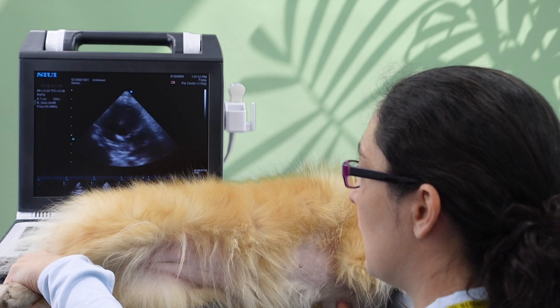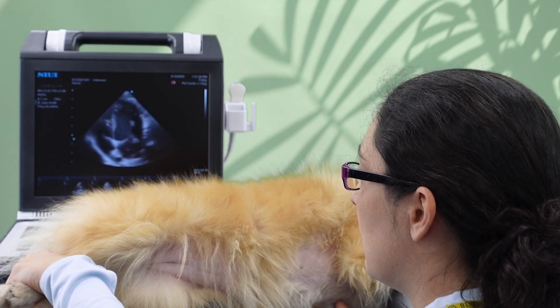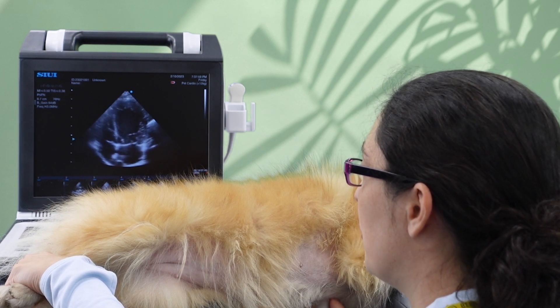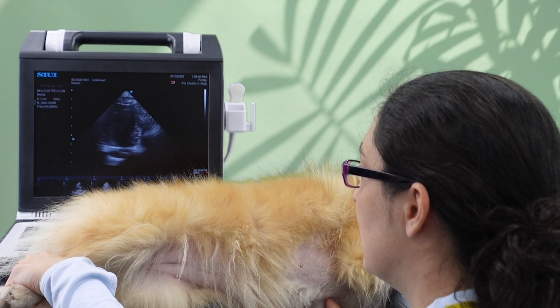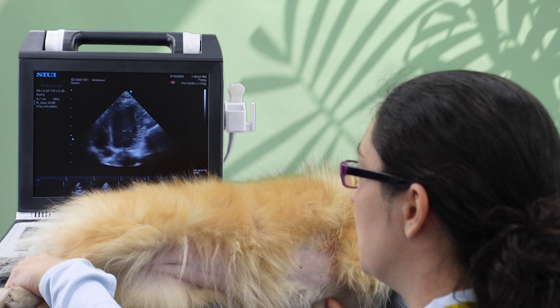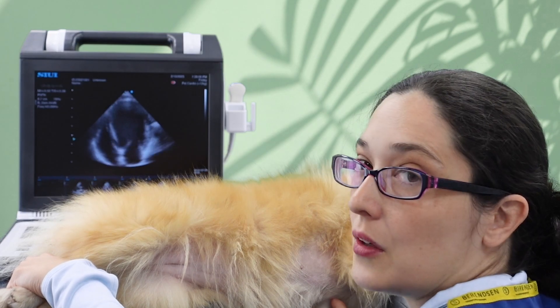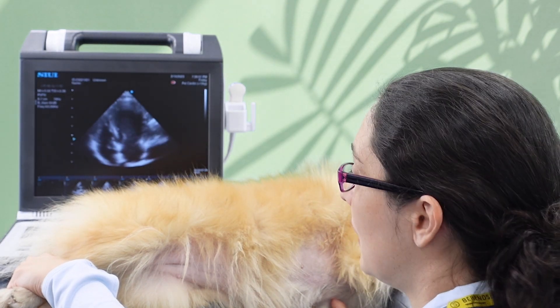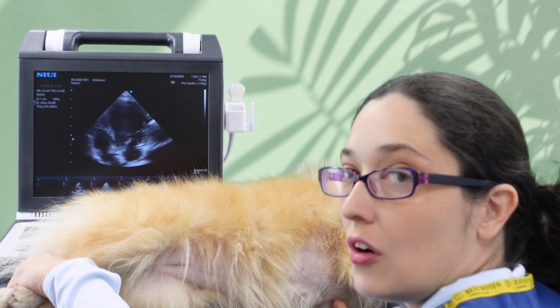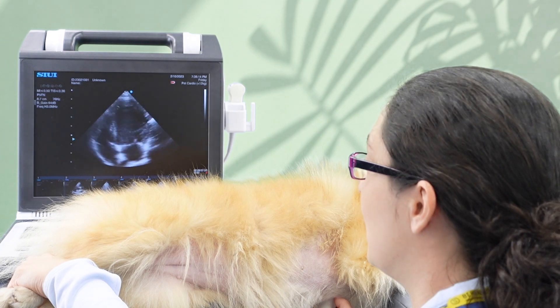If this happens, slide down a rib space. In fact, I would recommend sliding down as many rib spaces as you possibly can until the point at which you lose an image altogether. The furthest rib space you can go down and still get a nice image of the heart will be the most on-axis and least foreshortened image that you can get.